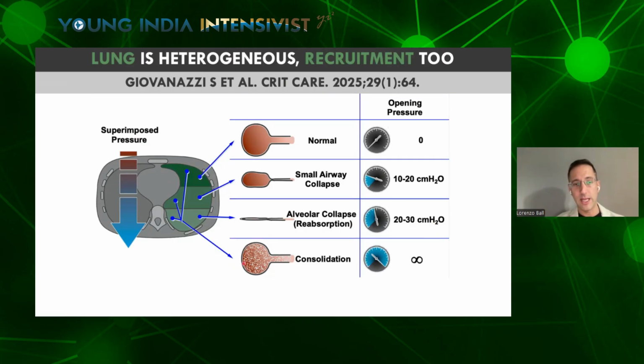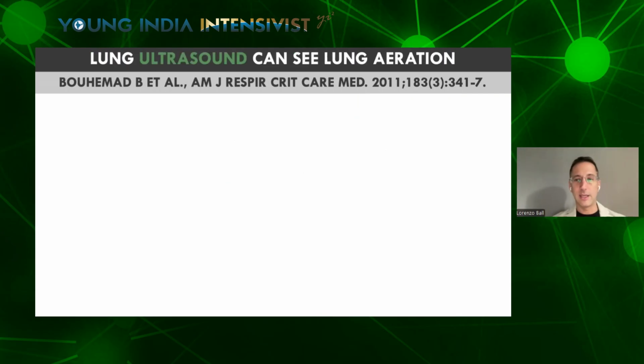And then I will have consolidation, which can be dorsal, but for example, in bacterial pneumonia, can also be located heterogeneously, even in the ventral regions, as we all know. And these regions, if they are consolidated, there is no pressure that will ever manage to reopen them. We have seen that CT is one technique that can measure very precisely at the regional level how the ventilation is distributed in response to a certain setting of the mechanical ventilator, but there are several techniques which are much more convenient that can be used at the bedside.